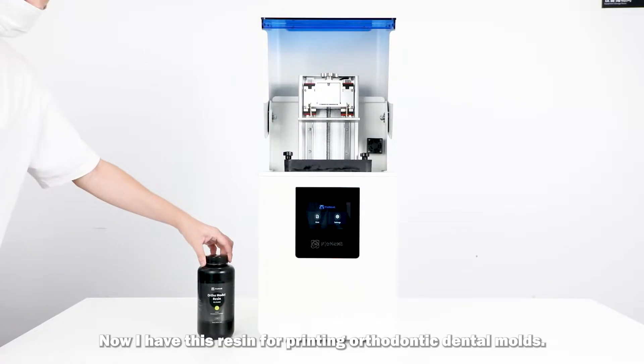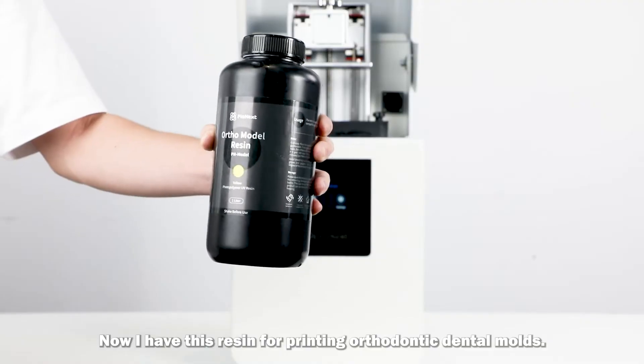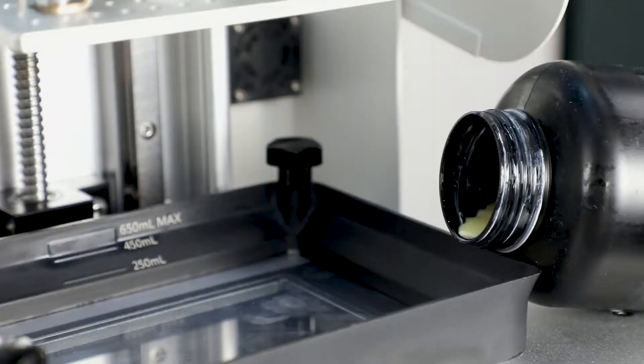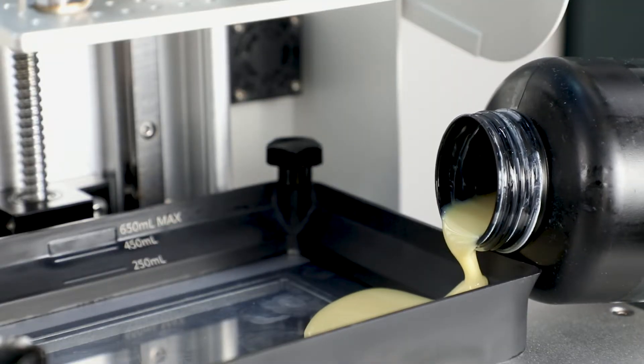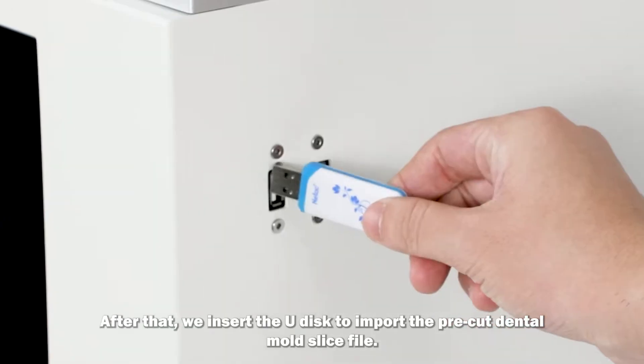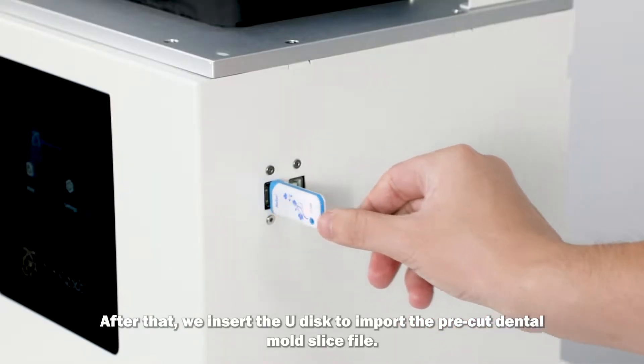Now I have this resin for printing orthodontic dental molds. Before pouring the resin, we need to shake it a few times to make it even. After that, we insert the U-Disc to import the pre-cut dental mold slice file.